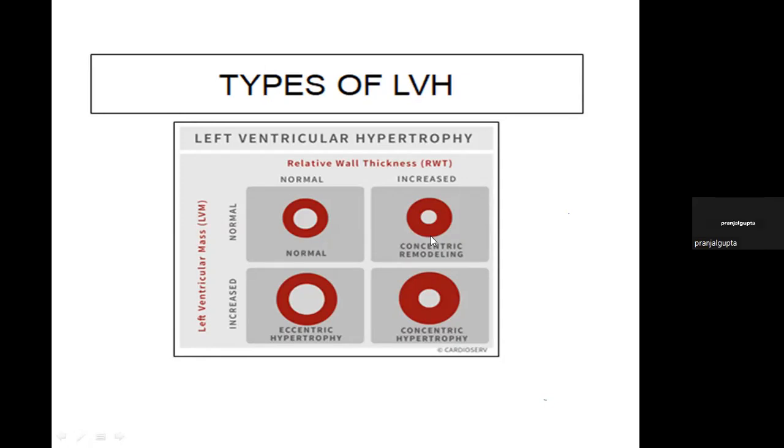Sir, we as beginners do mistakes. Our dimensions at 2D level and with M mode usually differ. M mode and direct dimension measurements usually differ. Then in 2022, we should talk of direct measurements. We are not talking of M mode measurements anymore. Sir, what is the main importance of M mode in modern echocardiography? M mode in modern echocardiography is useful in many things. To name a few, in ICU setups where we're looking for MAPSE, LV systolic contraction.